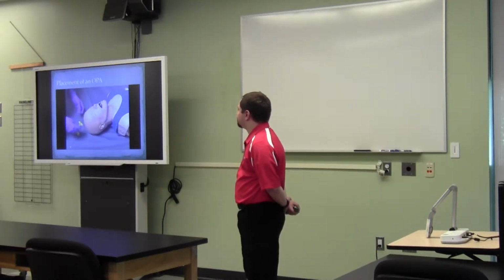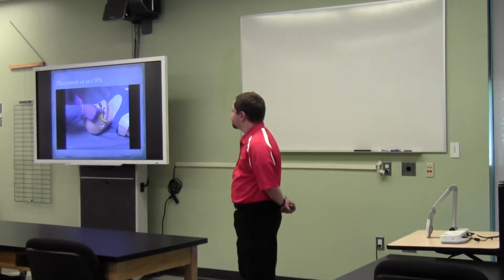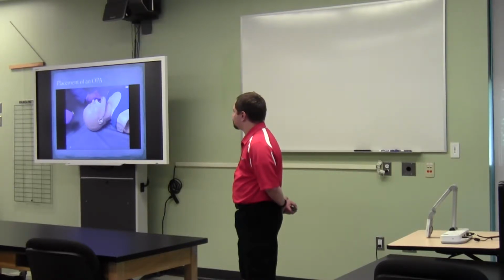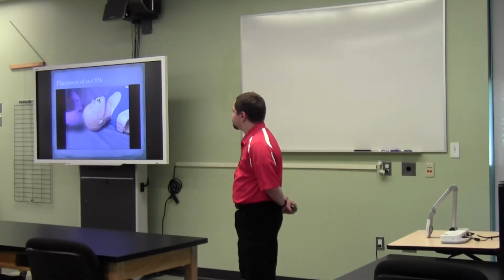The way to determine the appropriate size oral airway for an adult patient is to measure the airway against the side of the patient's head. The oral airway should extend from the corner of the patient's lips to the bottom of the earlobe or the angle of the jaw. Once the correct oral airway is selected, open the patient's mouth using a cross finger or scissor finger technique. The airway is then inserted into the patient's mouth with the tip pointing toward the roof of the mouth. Once the airway touches the soft palate, rotate the airway 180 degrees into anatomical position with the flange resting against the lips or teeth.